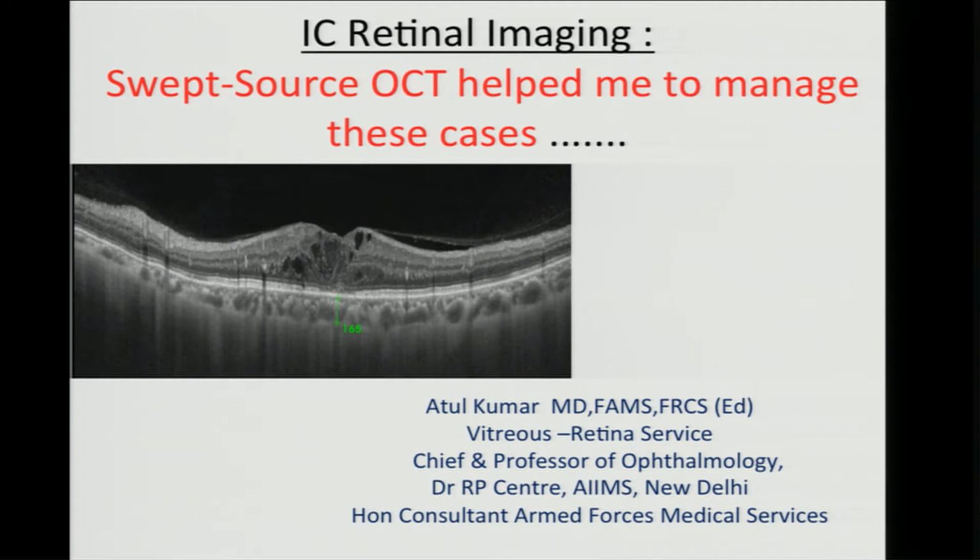Now, this is a very interesting topic, and the basic concept is excellent, that each new equipment or imaging modality is helping pick up retinal pathologies which were not unheard of, or heard of but not seen. So with the advanced imaging modalities, now we can pick up these. And how do they help us? I think whoever designed it made a very nice decision.